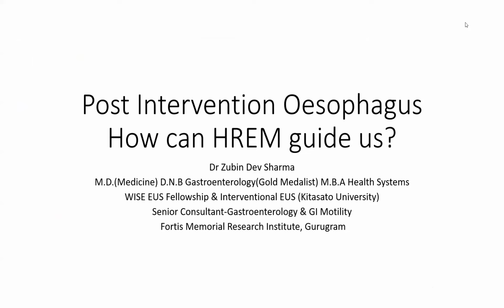So, to begin with, the topic that we have today is slightly different from the normal ones that we all see when we talk of manometry. We'll talk of an esophagus which already has an intervention done, whether it is an endoscopic intervention or a surgical intervention. There are a lot of issues here that we will discuss subsequently, and we will try to create a protocol, although there is no standardization across the board, where we can use manometry as a guiding tool for our subsequent treatment.